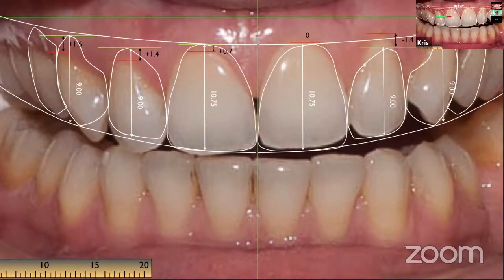This is the type of communication which we can read from these pictures and transfer to orthodontists, for instance. So this gives us very clear information on where to move the teeth and how to communicate to the patient, and especially to orthodontists, what we expect, because sending a patient without information is just a lack of information. And then we cannot expect that this type of treatment will go very well.